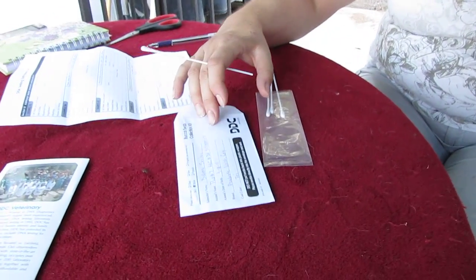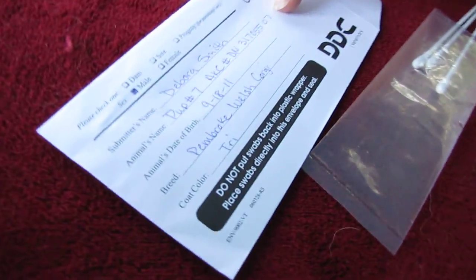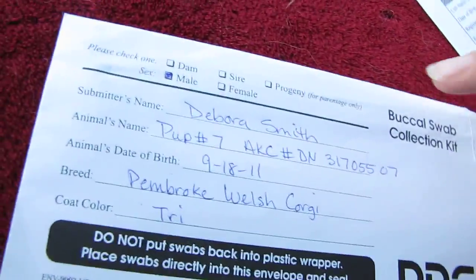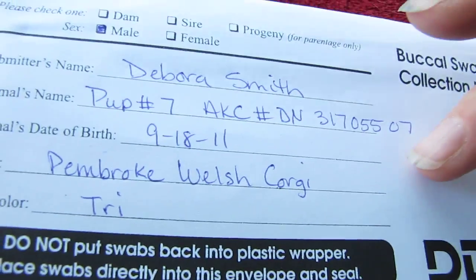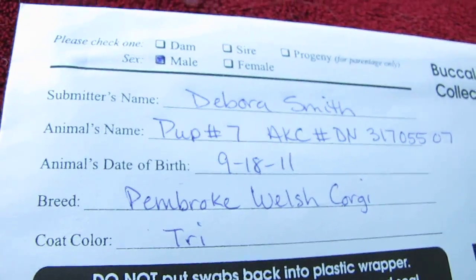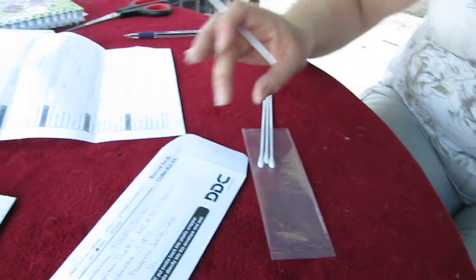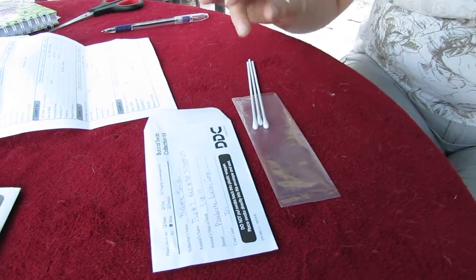What we're going to do is: you will have a kit that comes to you — it's an envelope kit. You fill out your information with the puppy's registration number, date of birth, breed, color, and whether they're a male or female. The kit contains four swabs.